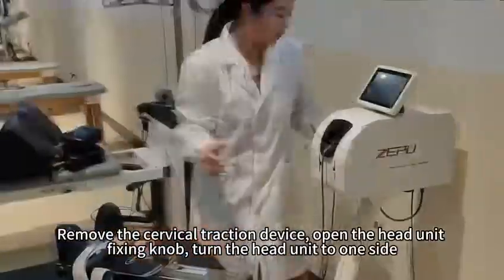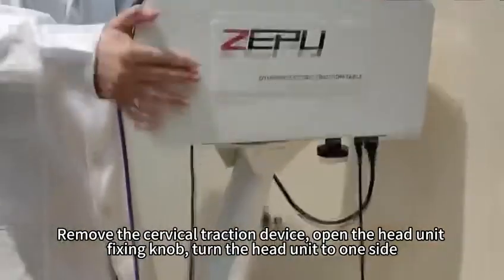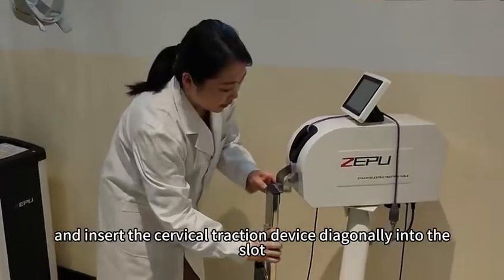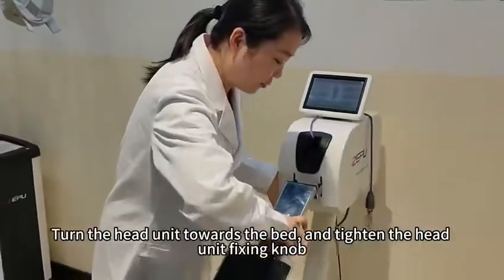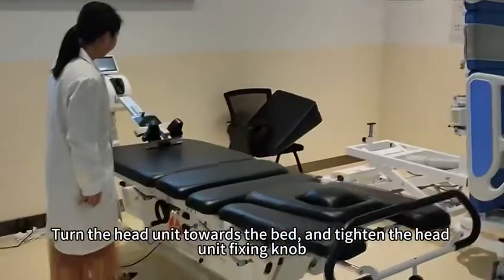Remove the cervical traction device. Open the head unit fixing knob, turn the head unit to one side, and insert the cervical traction device diagonally into the slot. Turn the head unit towards the bed, and tighten the head unit fixing knob.